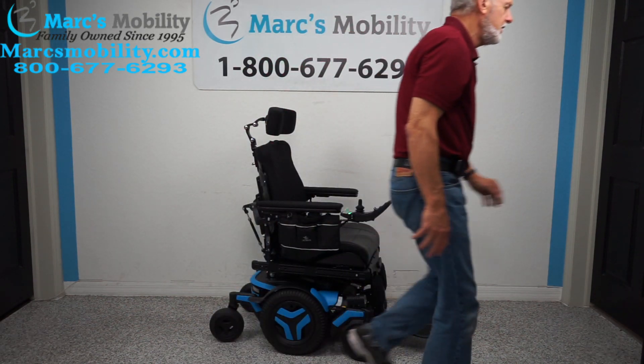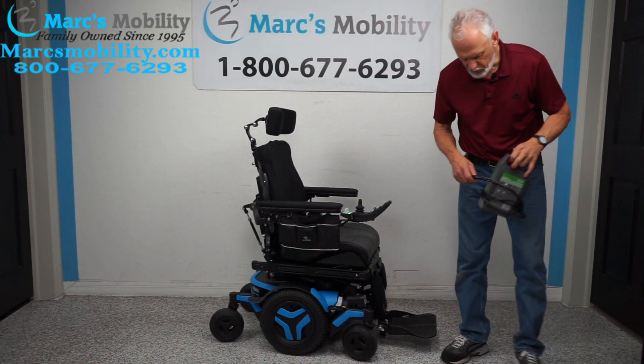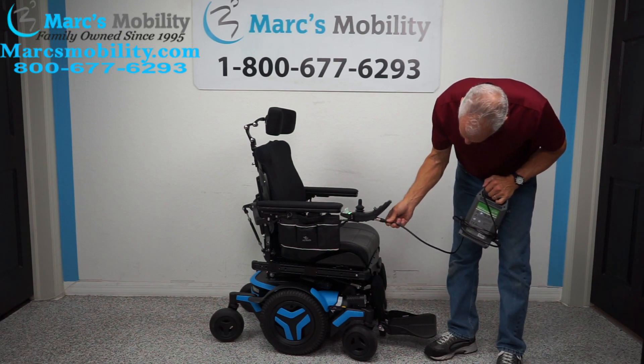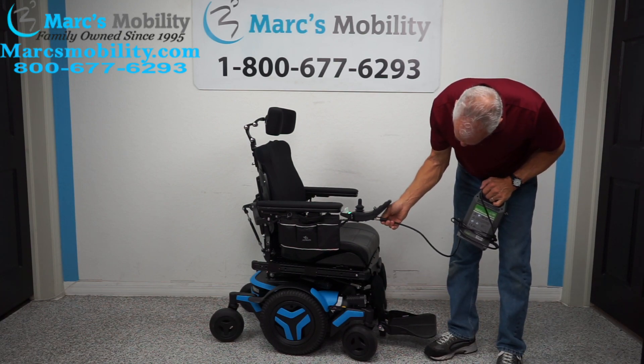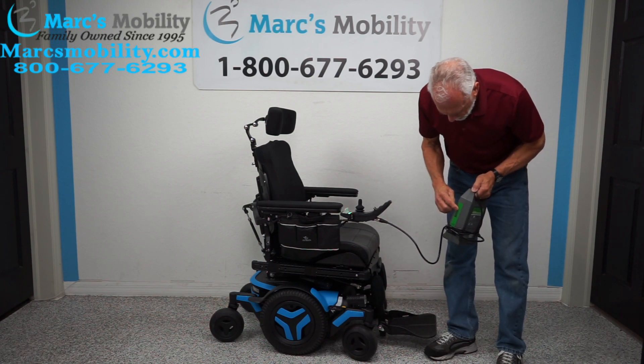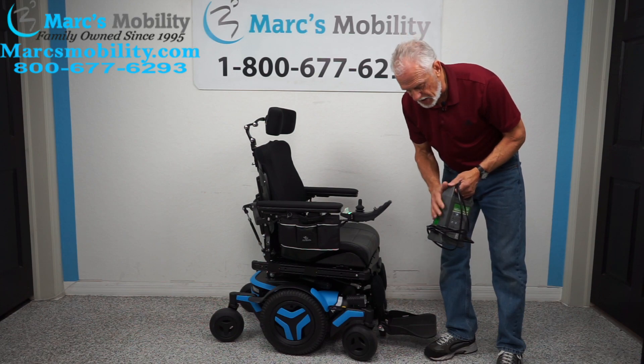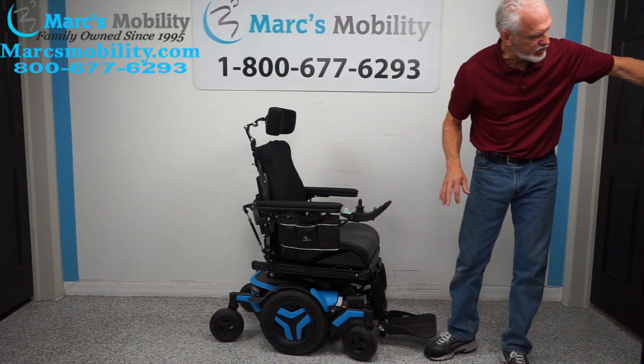When you charge this chair, take your Permobil charger and plug it right in. When the light goes to green, the charger shuts itself down automatically — it will not overcharge. These are smart chargers.